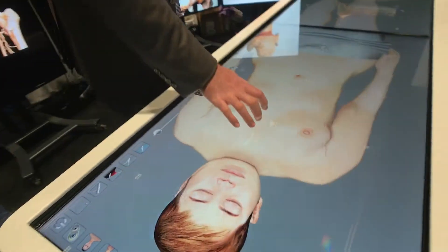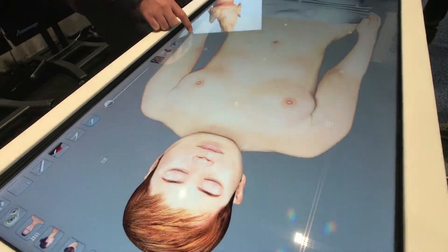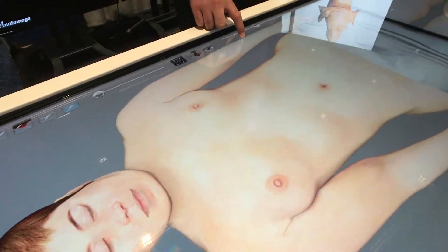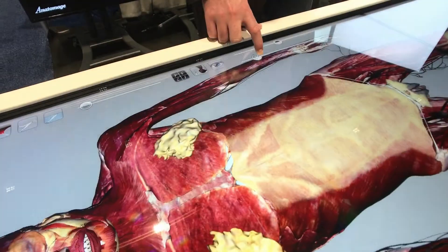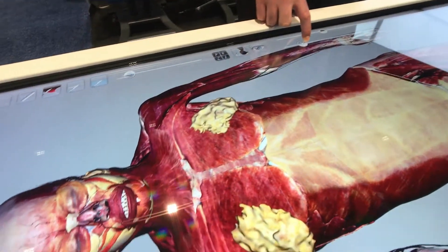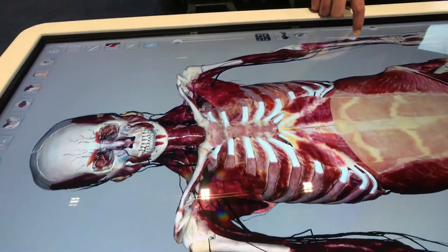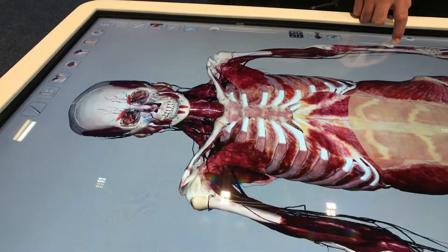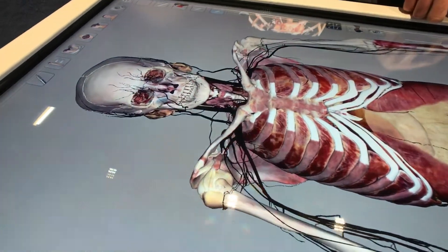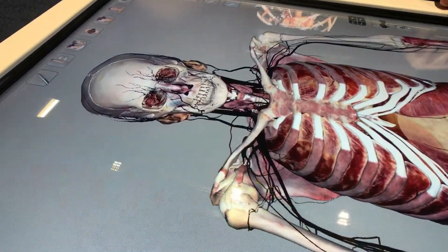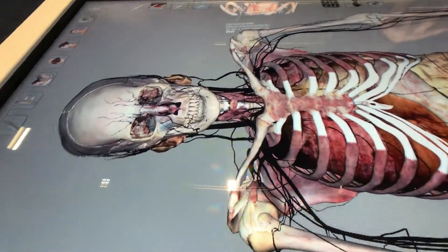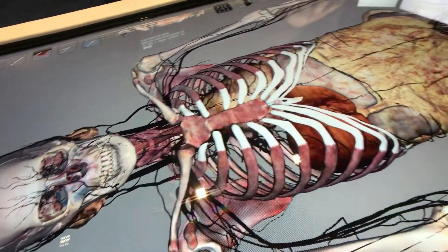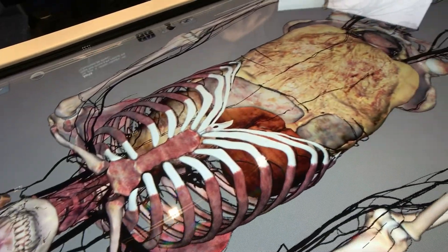Let me show you how to go through the different systems in the body. I can quickly peel back some of the top layers, go system by system downward, to really get a better idea of all the different parts of the body.